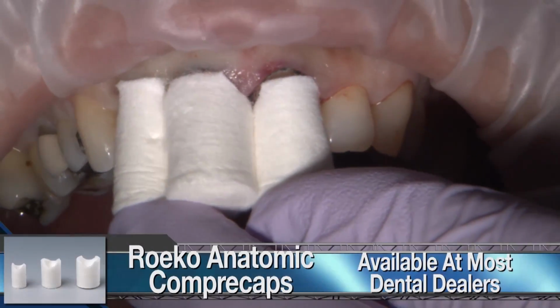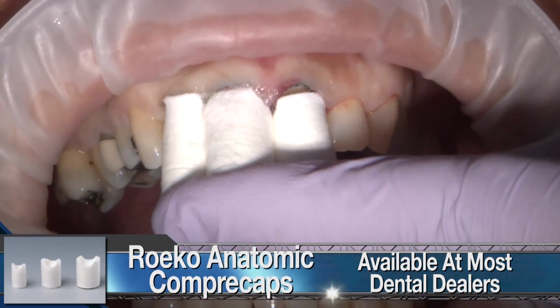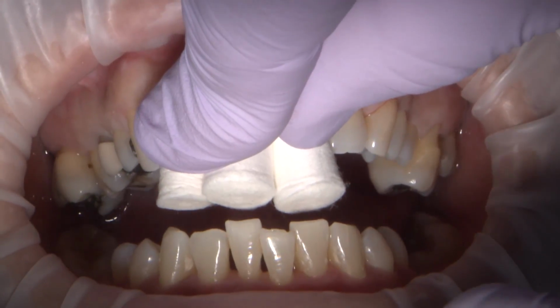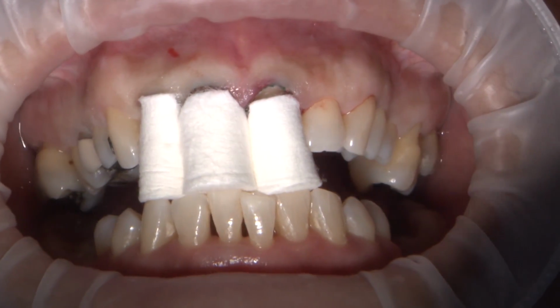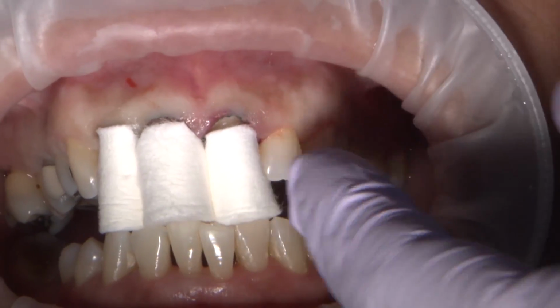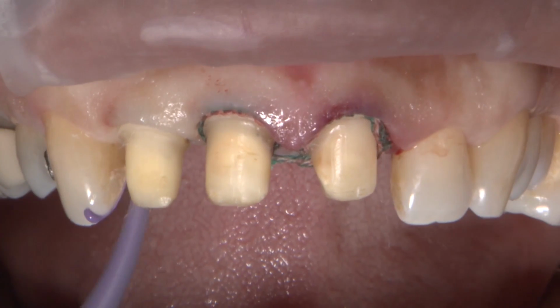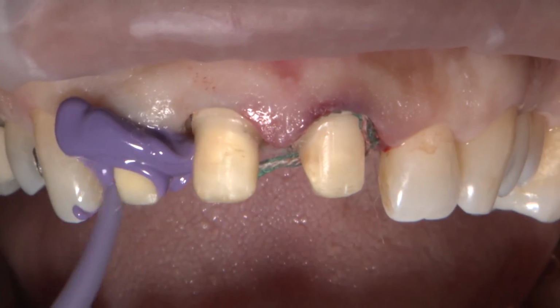To keep the cord in place, keep the area dry, and provide pressure on the tissue, I use anatomical cotton caps. I like anatomical cotton caps because they are pre-cut for mesial and distal areas to avoid pressing too much on the papilla and allow the cotton to reach the facial and palatal margins. We keep them in place for about 7 minutes before removing the cord to take the final impression.